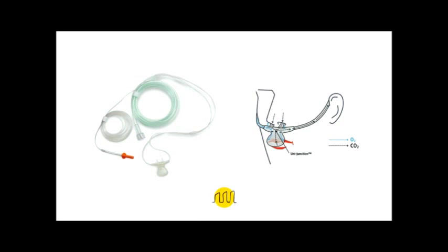And what happens is you have a nasal cannula where you're able to deliver oxygen to the patient, and then it's sampling intermittently the CO2 for the patient, and it samples it by what's exhaled through the nose and the mouthpiece. And that area that says unijunction in the picture is an infrared spectrometer that's able to measure the wavelength of CO2. It's a specific wavelength. And then that gets displayed onto the screen as a number. So these are the two types that we have available for us here. And that's it. That's the brief review that we're going to go with.